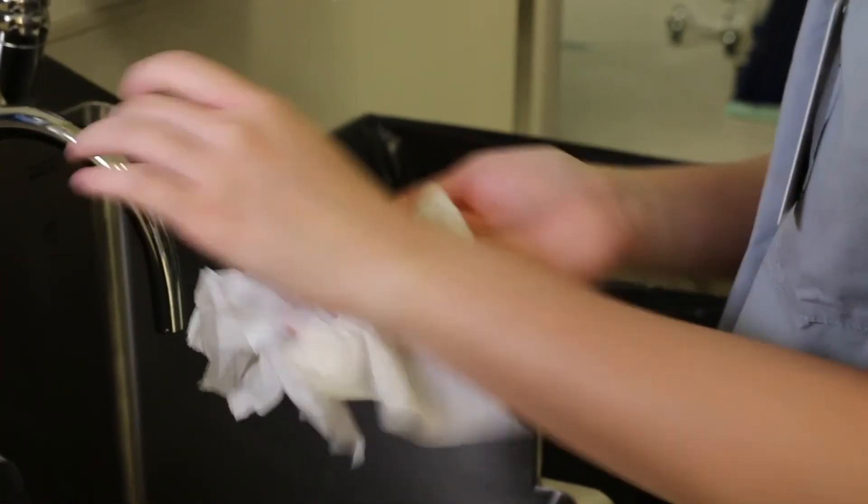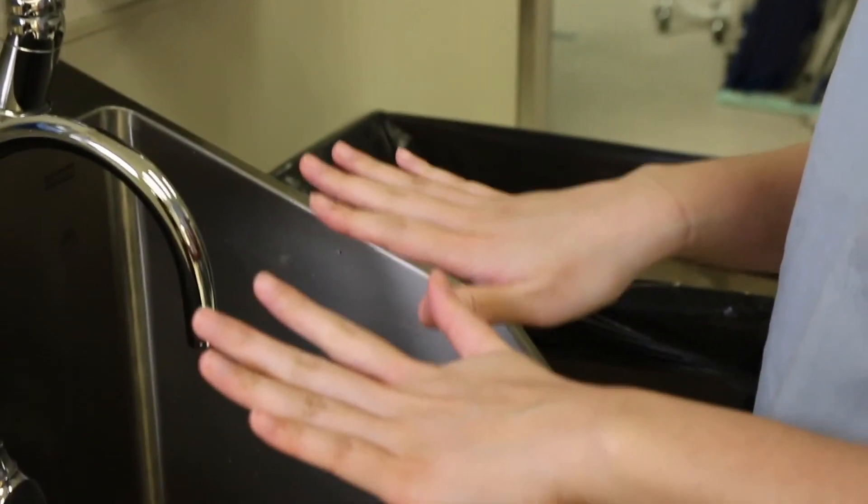It is very important that you never clean your hands or eyewear in the patient's personal hygiene sink.